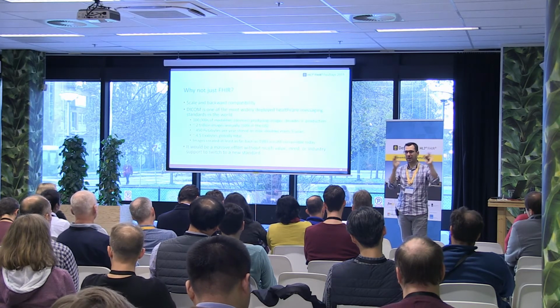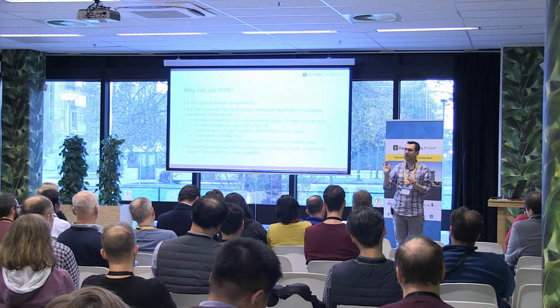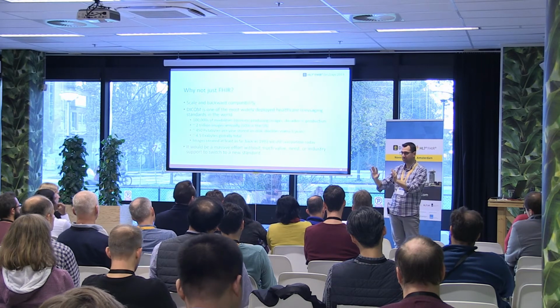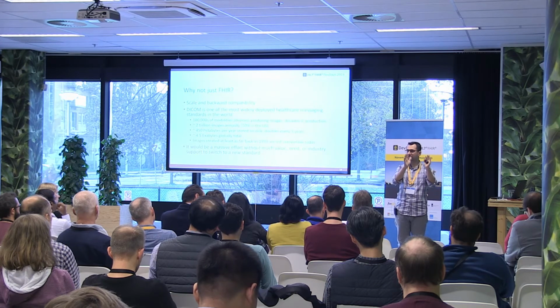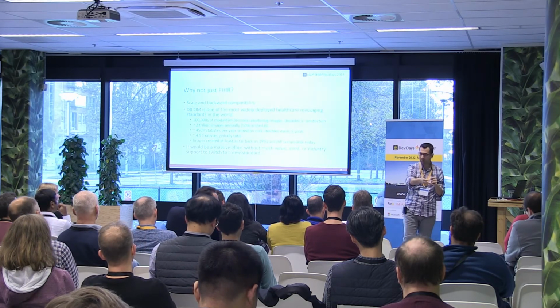So if you imagine a radiologist reading studies, they'll usually have typically 3 applications open. There's PACS, which is used to view images and manipulate images. There's the EMR, or RIS, depending on what you have. And then there's usually voice dictation software, which is what you use to dictate reports.